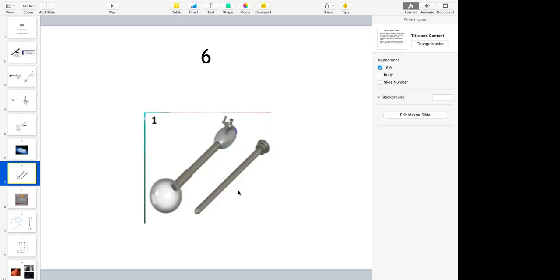To create space initially, while creating the space. Yes, there you have seen this being used. Any other use? If you are doing a retroperitoneoscopic procedure, again to create space, you may use it. What kind of telescope will you use for space creation? 0 degree. That is important. A 0 degree scope is used with this kind of trocar and cannula.